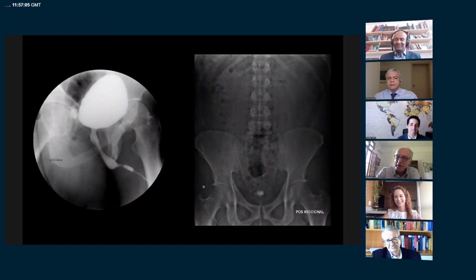I think radiography is the study for diagnosis, ultrasound helps in the anterior urethra, and MRI helps in the posterior urethra. Like some years ago, when we planned a trip, we went to the internet to check the temperature and the weather where you're located. Nowadays, when you perform urethral surgery for stenosis, the more information you have, the easier your surgery, and you know what you have, and don't make decisions during the OR.